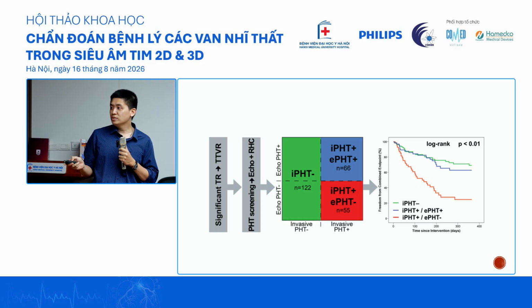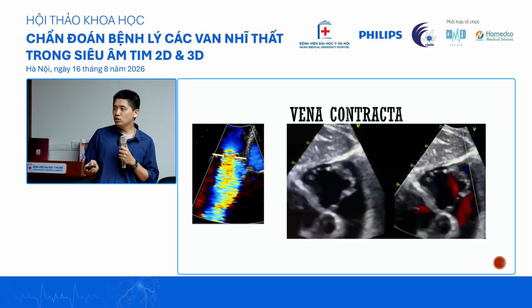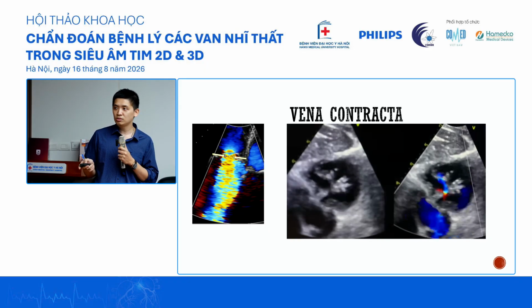But on outcome, we see that the patients who have actual pulmonary hypertension on invasive measurement but no sign of pulmonary hypertension on echo are actually the ones who do much worse. For these patients, usually the ones with longer disease, they have higher right atrial pressure, and so they have the worst outcome. Another way you can do it is the vena contracta, but it's the same thing.